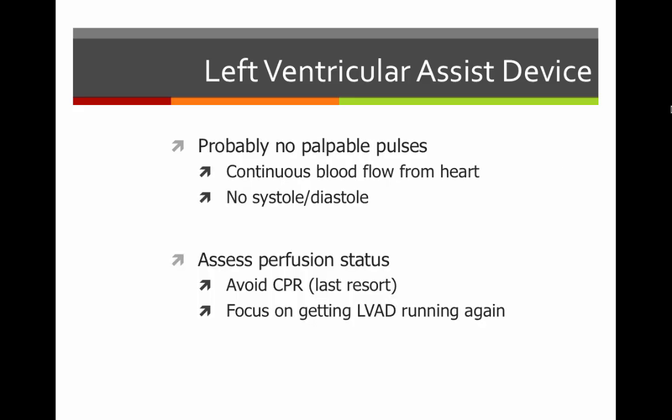Some big things to know about LVAD and LVAD patients. Hopefully they've alerted your 911 center and your EMS agency that they are an LVAD patient in your response area. These patients probably will have no palpable pulses. The newer generation LVADs have this continuous blood flow. They don't create palpable pulses because there's no systole, there's no diastole. It's just a continuous flow.